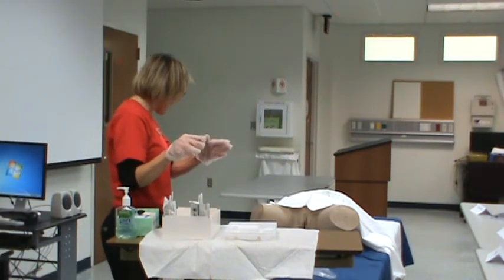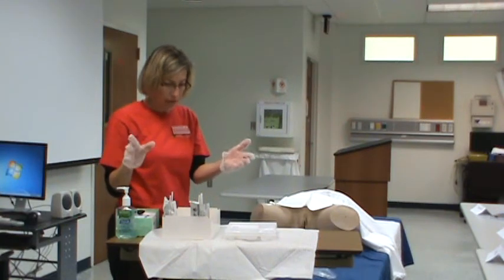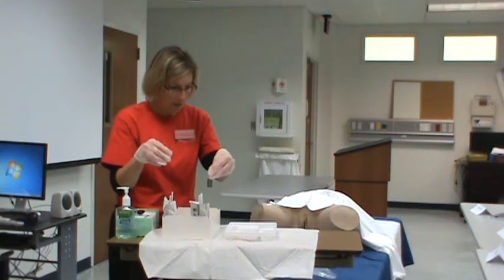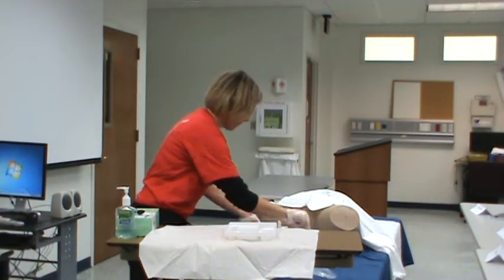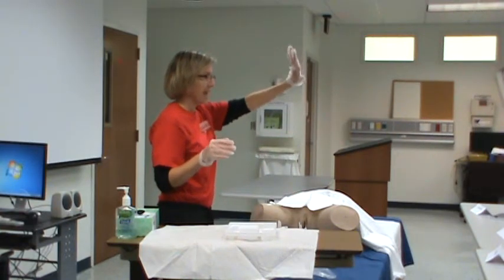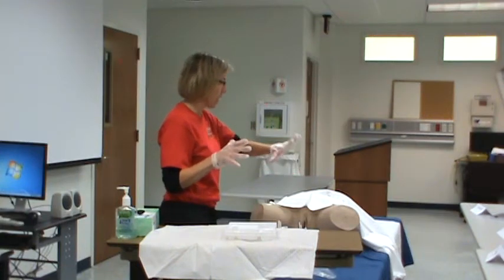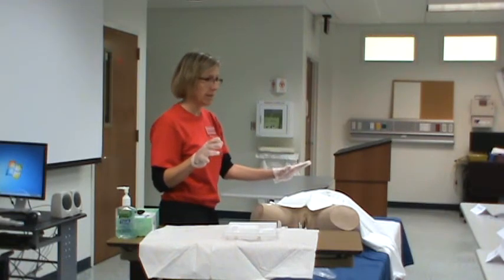Okay, so now I believe I'm ready. And this is where you can take your breath and be ready to move the kit on over in between Mrs. Smith. I've got everything I need. Let's do it this way. Okay, now is the step where you've got to be committed to lose a hand. This is the hand that once you touch her labia, once you touch the penis or the penile area, you can't move that hand. That hand is no longer useful as a sterile hand, okay?